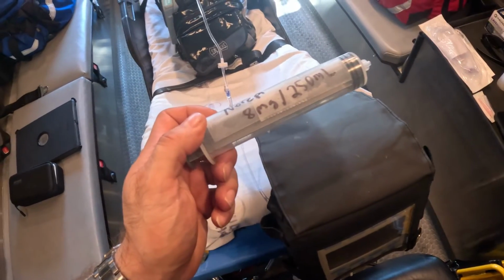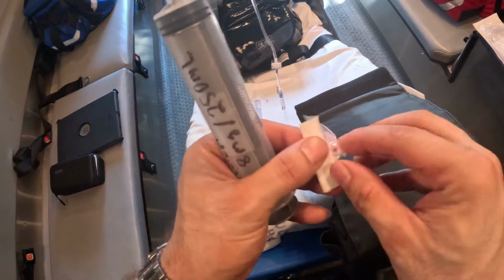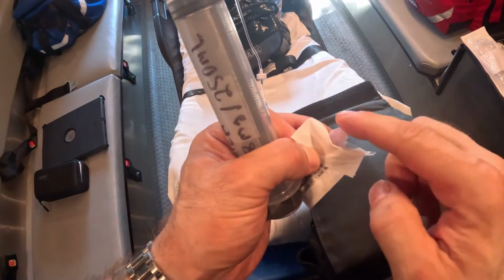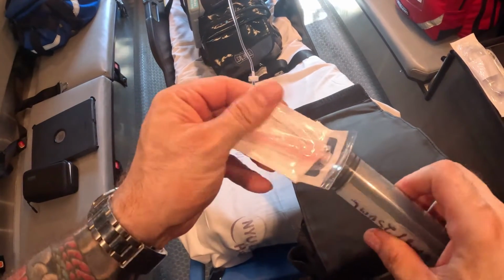And the next thing you're going to do is take your 18 gauge needle, which is here. Be careful not to touch this end with your fingers. You will contaminate it, so don't touch this end. Connect it like so, to your Luer lock.